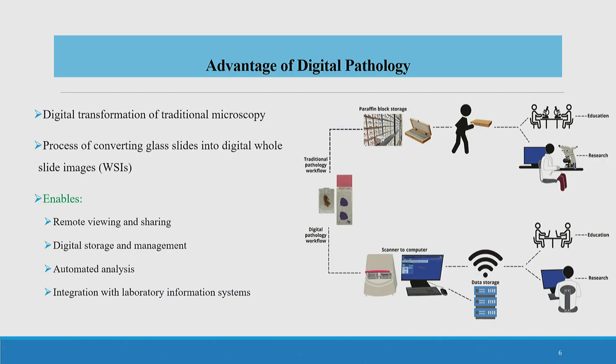whole slide imaging, then remotely we can access, for example, pathologists from across the world can access those slides and analyze the cancer. In our project, while sitting here, we are accessing the servers of those hospitals, and we are using those slides for our research purposes. This is a big advantage of whole slide imaging. If we have only the microscopic tissues, then we cannot access those remotely, as you know.